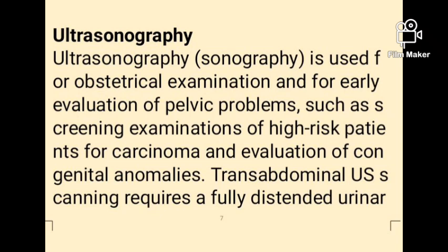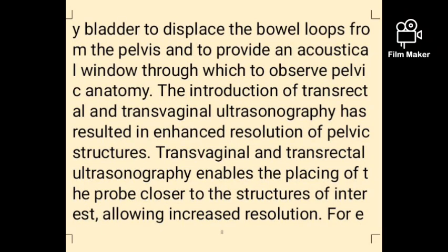Transabdominal ultrasound scanning requires a fully distended urinary bladder. You need this to displace the bowel loops from the pelvis and to give an acoustic window through which to observe pelvic anatomy.